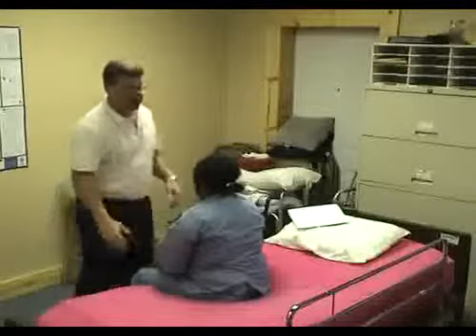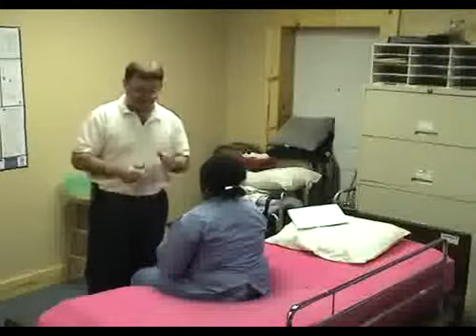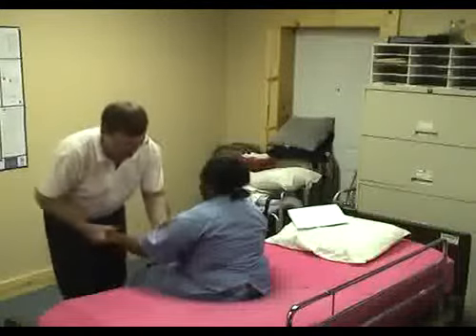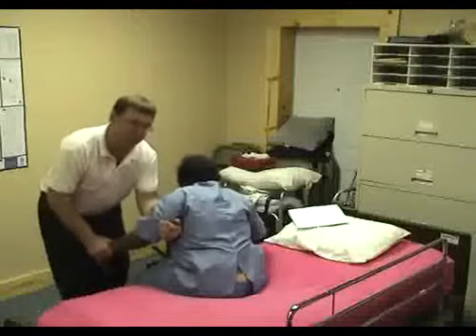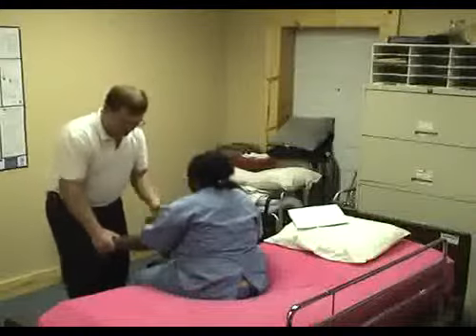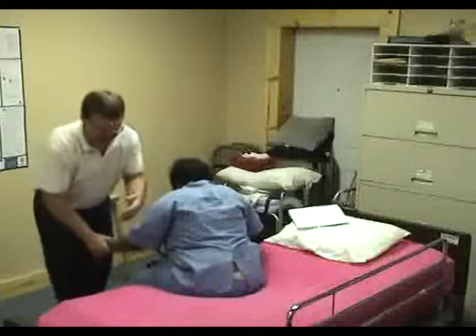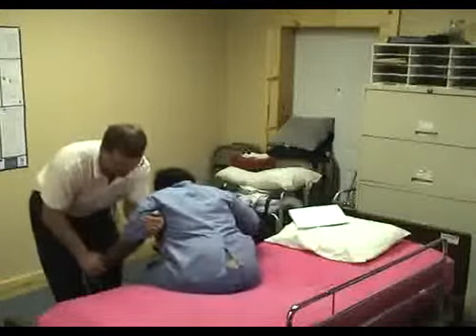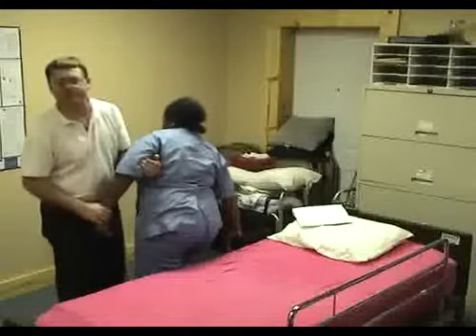The next one is someone that needs a minimal assist. Minimal to moderate. Well, I'd say 20% or more, up to about 40 to 50%, which means I'm going to do almost half. Put your right hand on the wheelchair, and you're going to get your nose over your toes, which is very important. Her nose over her toes. That way, she has that momentum going forward to push the rear end up off of the bed. 1, 2, 3, push. Good. So I did 20%. She did 80%.